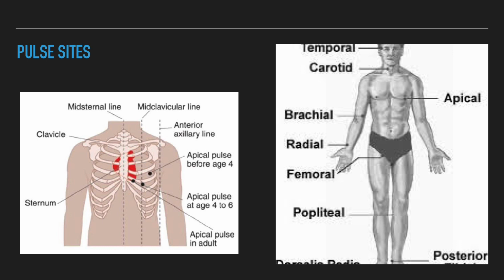The carotid pulse best represents the quality of pulsation in the aorta because of its proximity to the central circulation. Apical. The contraction or beating of the heart ventricles also can be palpated with the hand or auscultated with a stethoscope placed over the area of the left ventricle.